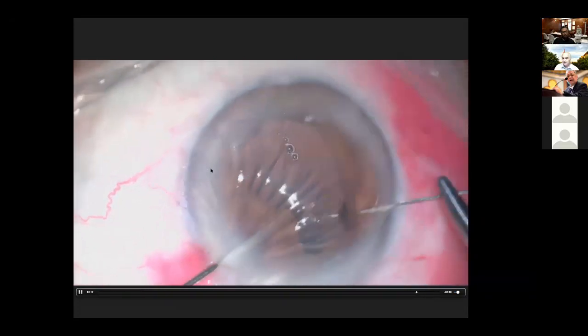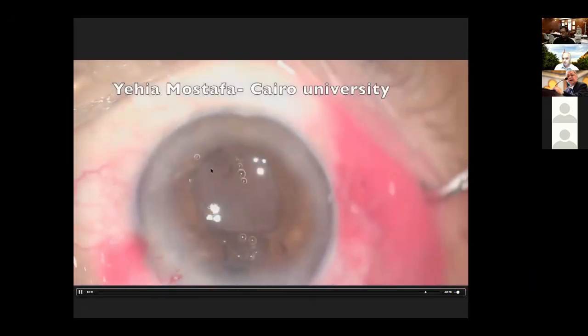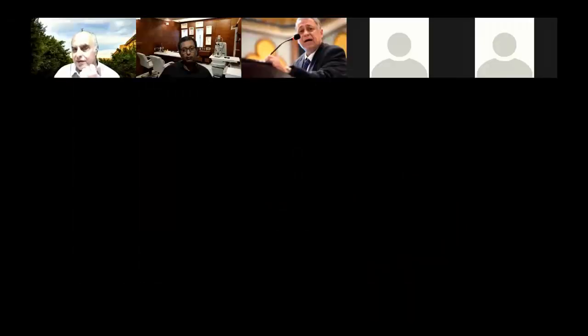And then after fixing the lens, I'm going to do an iridoplasty because this case had traumatic mydriasis. So the message here is that you should not use capsular hooks, iris hooks.